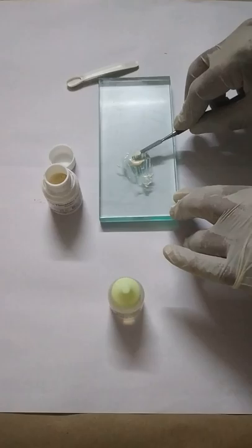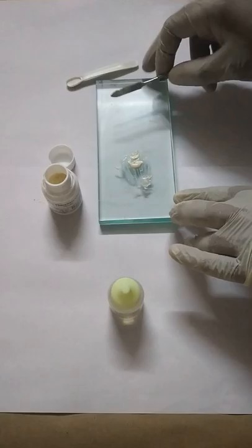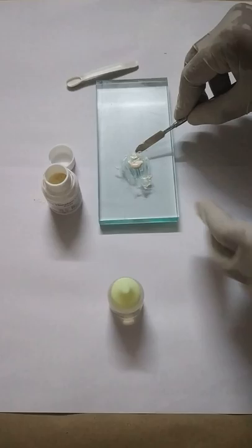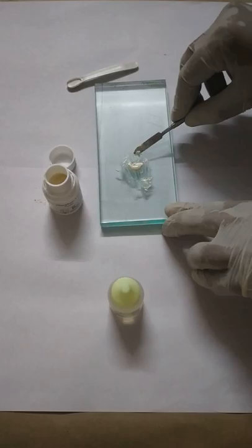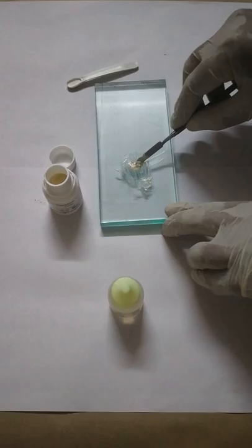Another method of using zinc phosphate cement manipulation is by using a frozen glass slab method. Frozen glass slab method is used to increase the setting time, increase the working time, and to incorporate more powder. That means you increase the strength, and it is used for cementing orthodontic brackets and other cementation.